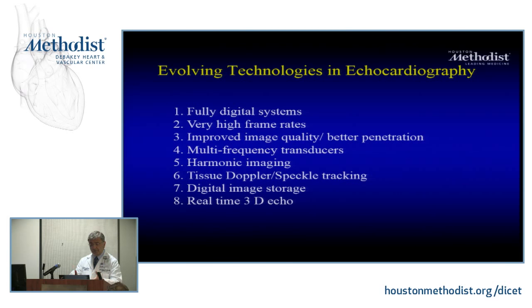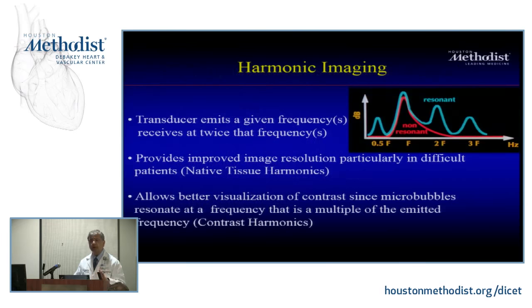These are, for those of you who have been in ultrasound almost like me, we've seen all this, okay? Meaning we were not digital at first, we became digital. Very high frame rate, we didn't have that. Improved image quality, multi-frequency transducer, harmonic imaging, and we'll talk about that, tissue Doppler, digital storage, real-time 3D. And this is interesting because it has happened from the early days of ultrasound. And it's not that old, really. So we've seen all this, and I'm glad you're at this stage of the game so you can take the technology further.